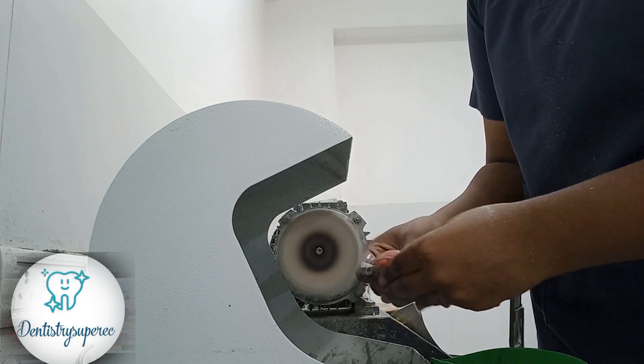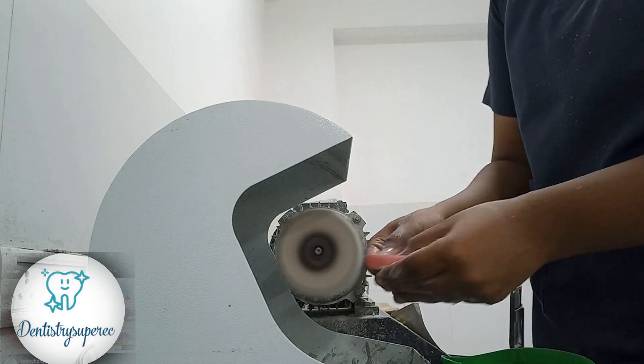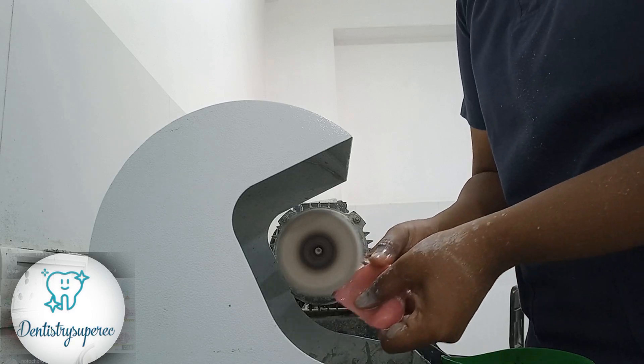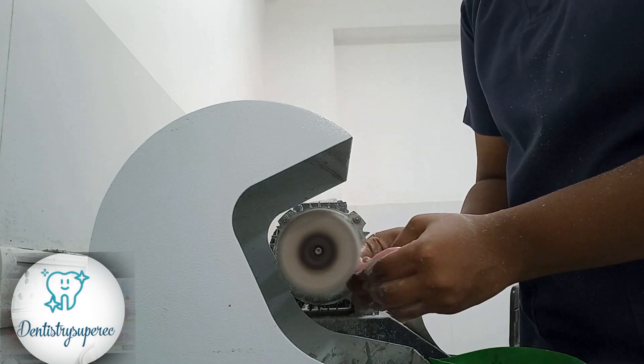Always be careful while doing the mandible because it's U-shaped and there are chances you can slip it off your hand. Always wet the surface of the denture and do it properly. If you feel there is any irregularity existing on the denture, please go back and do your trimming once again.